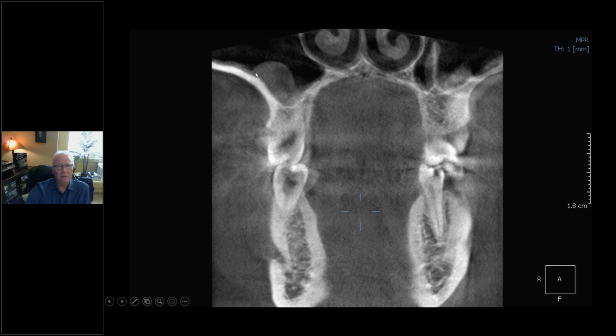The next one comes in, you see a dome-shaped radiopacity here within the right maxillary sinus. That's a mucus retention cyst, antral pseudocyst, whatever you want to call it. You'll tell the patient there's some minor inflammatory change there, but it's not going to reach up and block the ostium, the opening that we told you about between the sinus and the middle meatus. So end of story again, watch that radiographically.